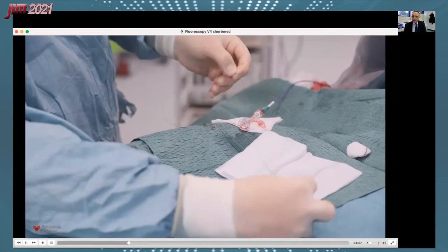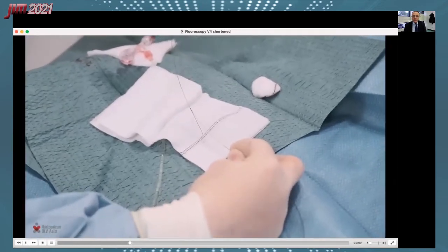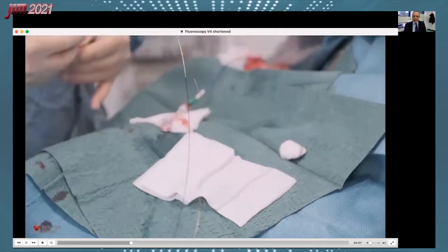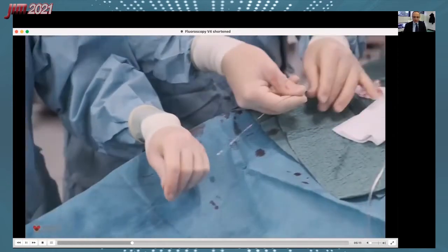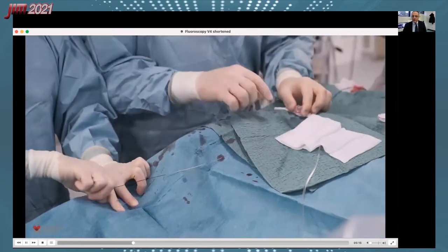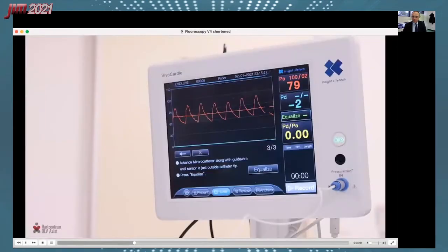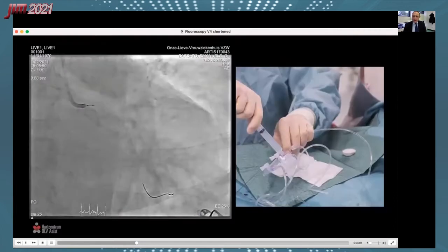Now you will see the guide wire coming out of the short monorail, just to give you an idea of the monorail segment length. And now we introduce the microcatheter within the guiding catheter, much like we would do with any kind of monorail balloon.